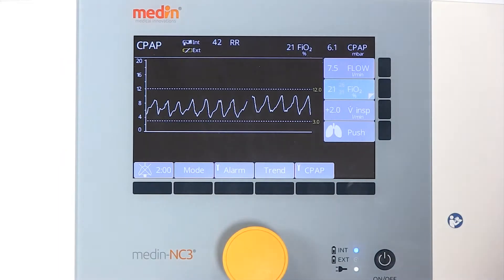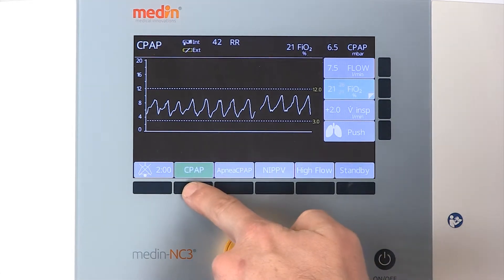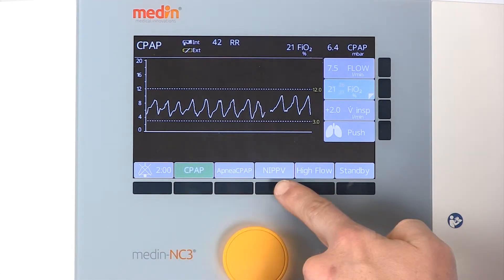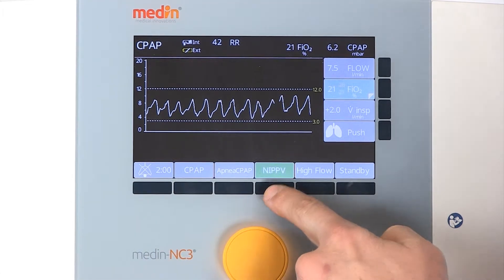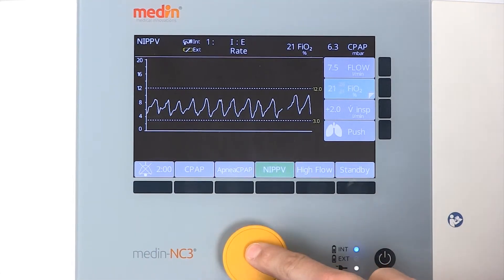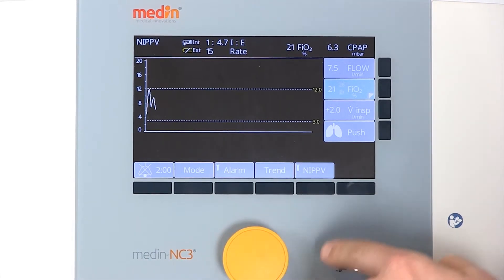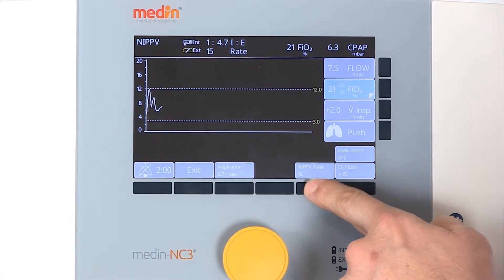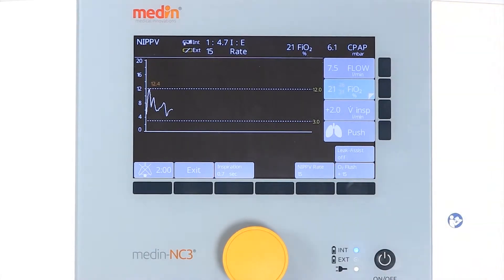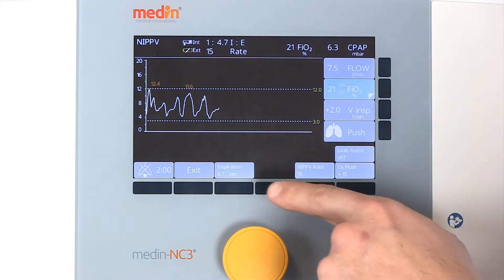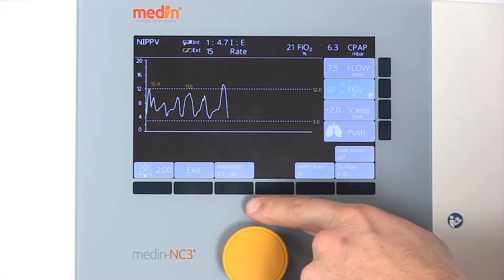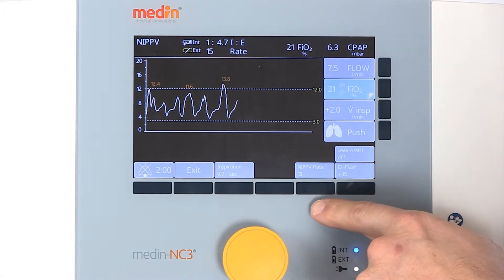The Medin NC3 offers a non-invasive positive pressure ventilation mode. During NIPPV, values such as inspiratory time, NIPPV rate and CPAP pressure can be changed as required.